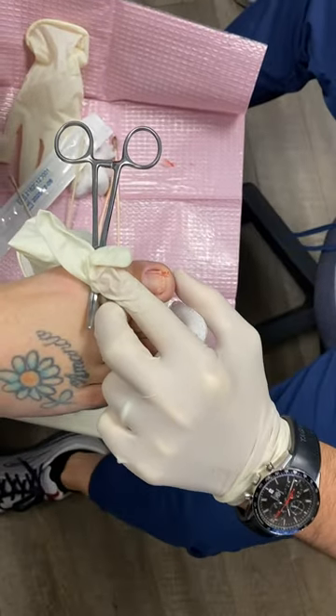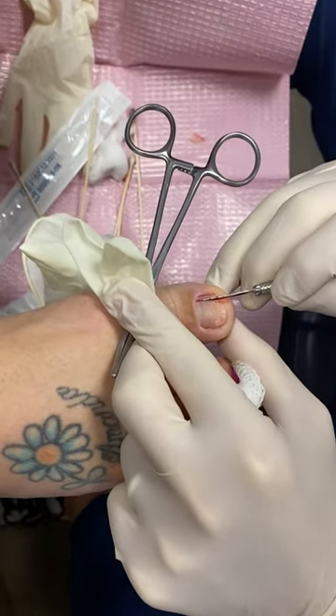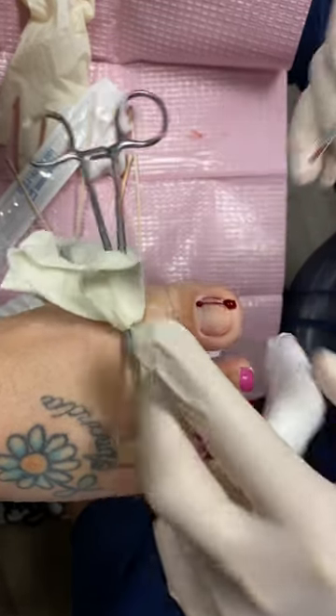And we're going to give it a nice crunch and clip that nail — you hear that nice sound. Then we're going to take another instrument called a number 62 blade, and we're going to squeeze it in that little groove, push it back, and that cuts through the nail all the way back to the base of the nail.